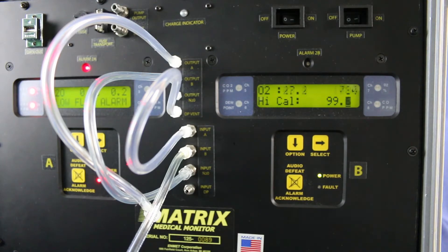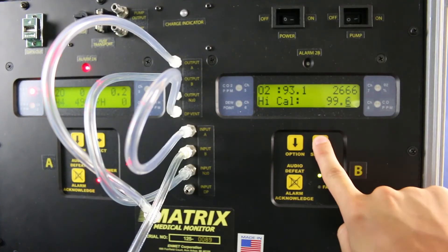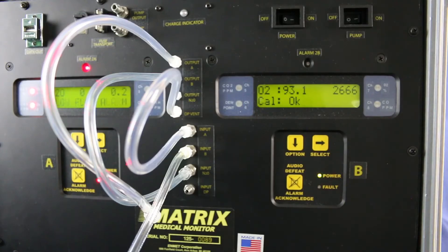Once two minutes have elapsed, press the select key to move the cursor to the right until the last digit is accepted. If the calibration was successful, the display will momentarily read 'cal ok' and then the slope and offset values will be displayed right after. This completes the calibration of your oxygen channel. You may now exit the maintenance menu and return to the operation mode.